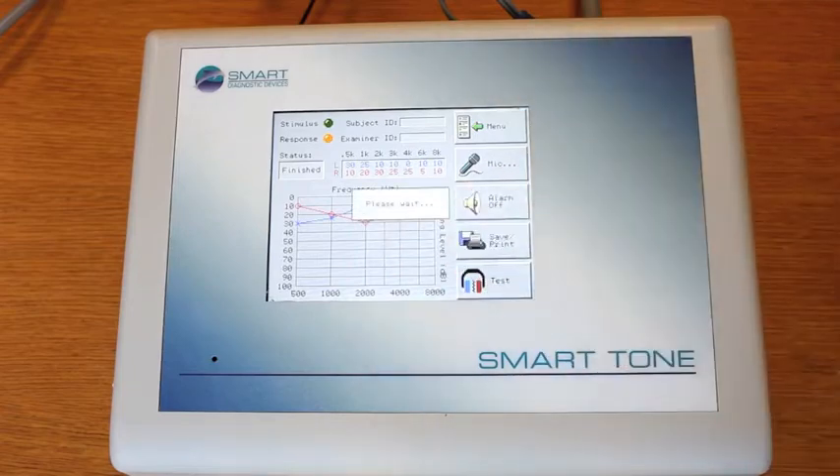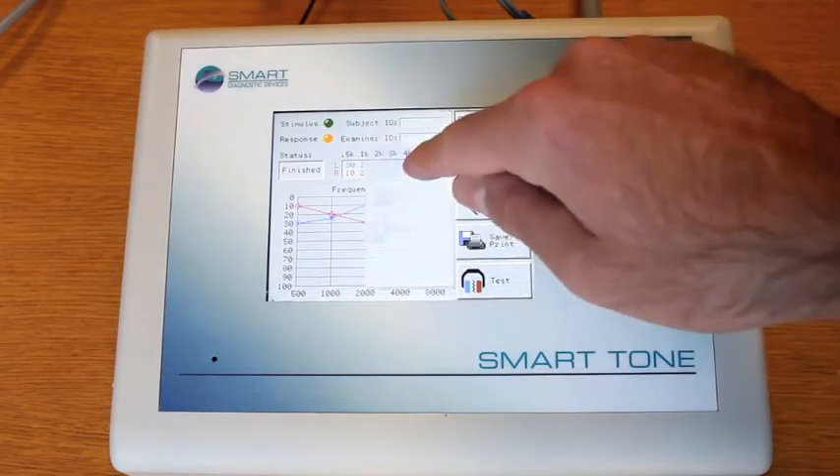Last, once the test is finished, you can save the audiogram to an easy-to-access database by pressing the Save Audiogram button.